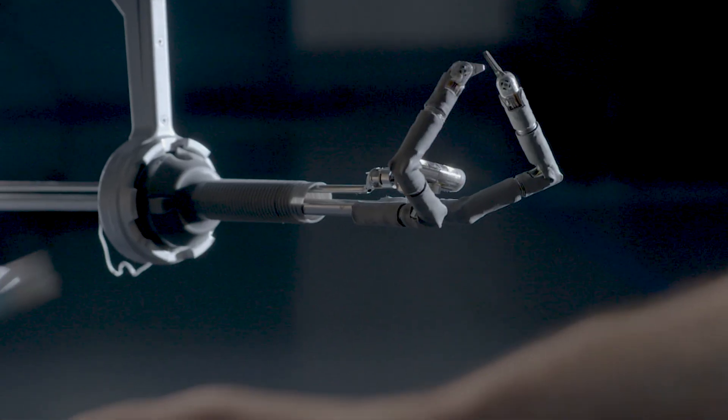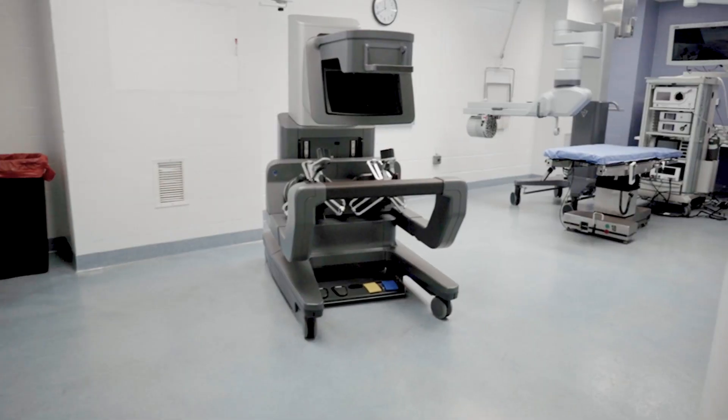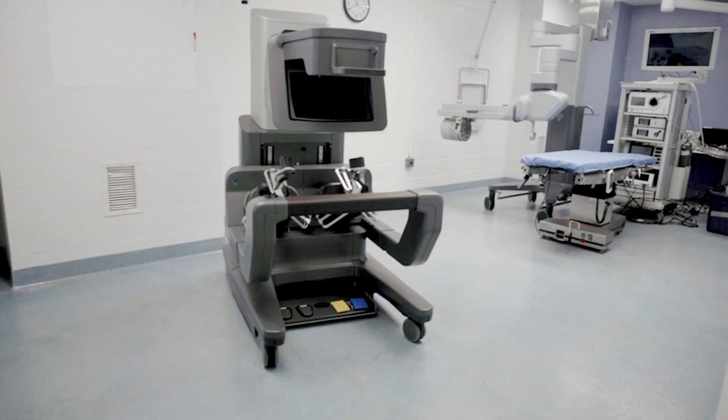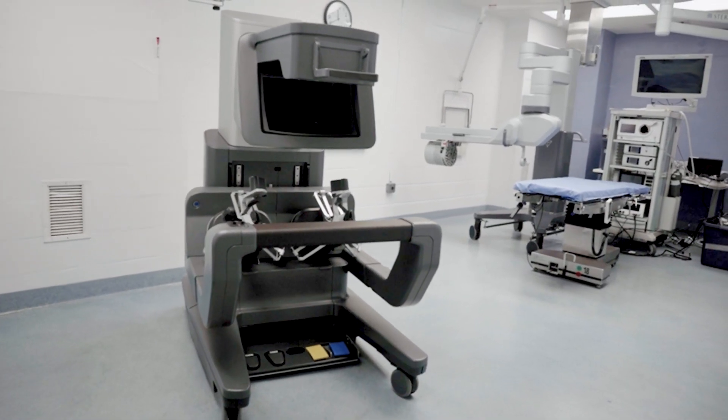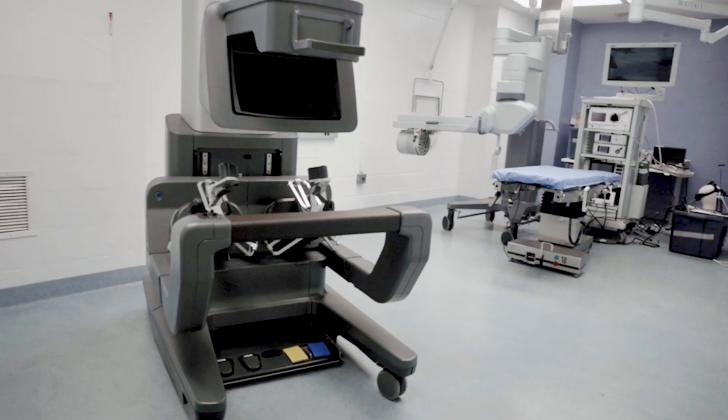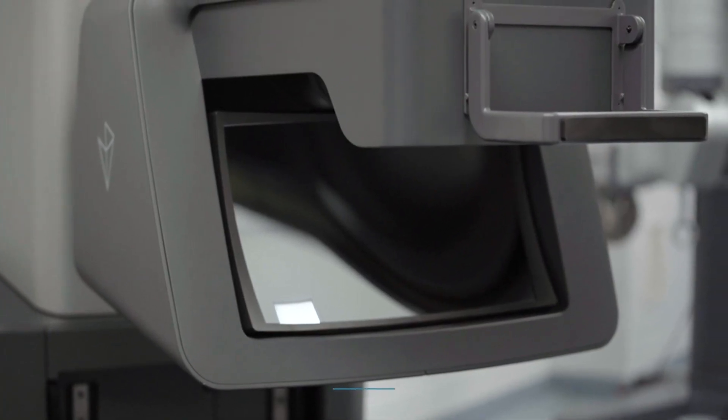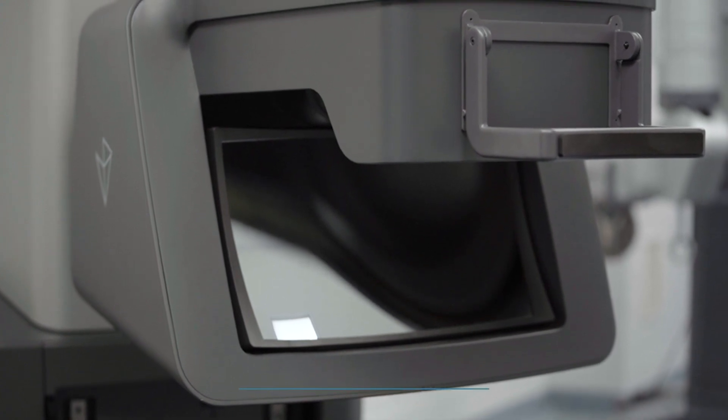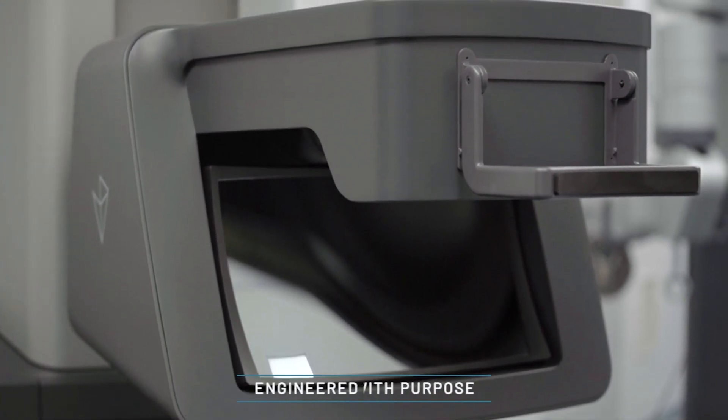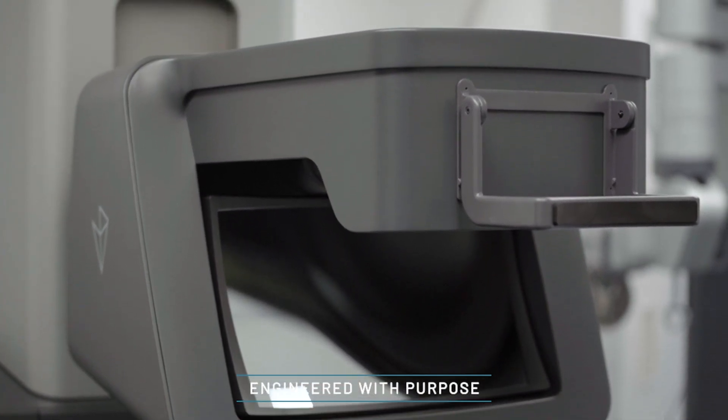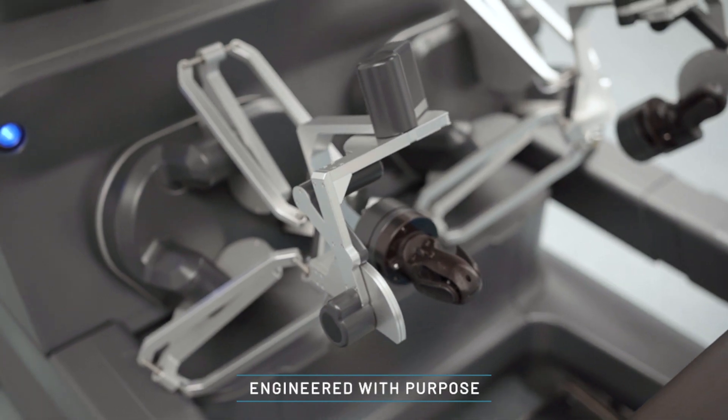rather than how to control the robot. The Vicarious Surgical System has just two pieces of capital equipment, the surgeon console and the patient cart. Both units are compact and portable, taking up a fraction of the space of existing robotic solutions.